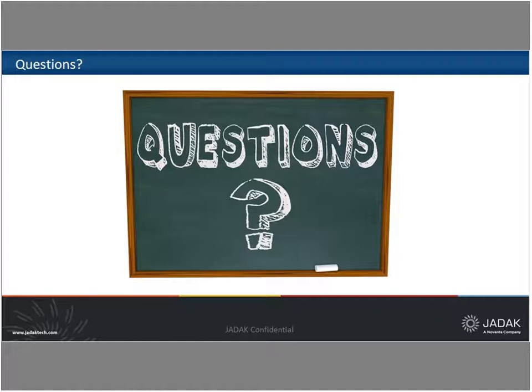Cool. Another question is, what are some other examples of how RFID can be used in clinical diagnostic applications? We covered the basics here. Most of the clinical devices obviously have to do with protecting and verifying the reagents or the cartridges, which are really the razor and razor blade model for most of these companies, where they want to secure the continuous cash flow from the use of their specific reagents. But there is one that comes to mind that's a little different.